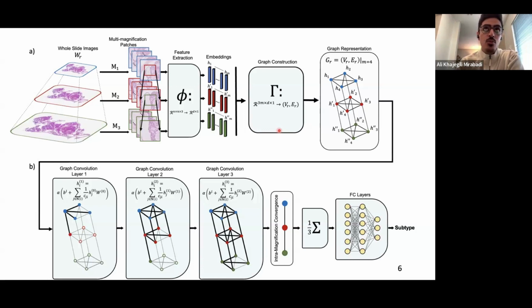If we want to have a really good foundation model, the first thing is that the model needs to understand different magnifications. Yes, people use scaling and augmentation in their training, but that doesn't do it. We need an architecturally informed model that can understand different magnifications to get pooling. I've not shown it here, but we have done experiments where we extracted features from lower magnification and compared them with higher magnification.